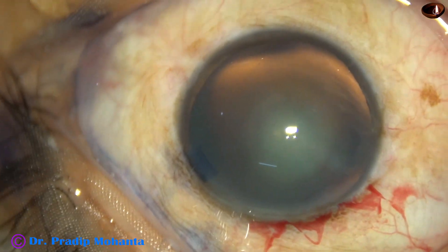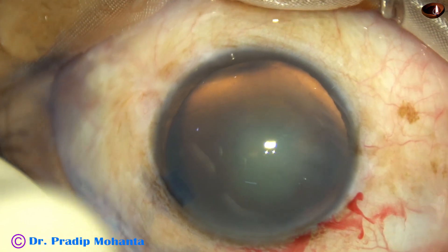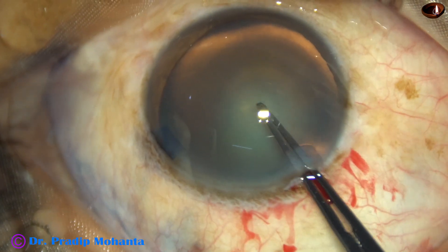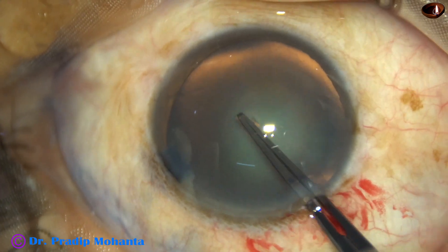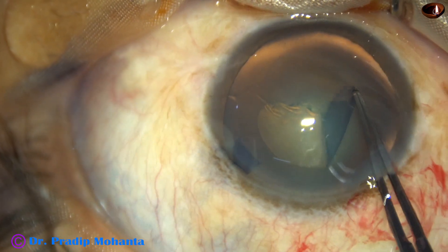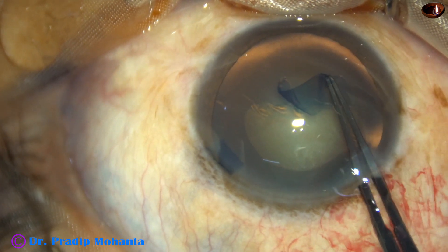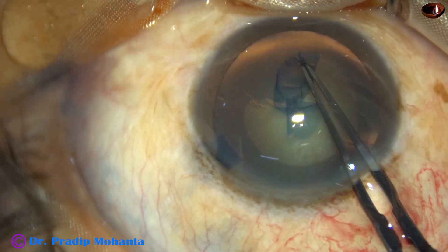And now, let us see rhexis with utrata forceps. The utrata forceps goes in, pierces the center of the capsule. And now, the capsular tag is guided anticlockwise and the rhexis is performed.